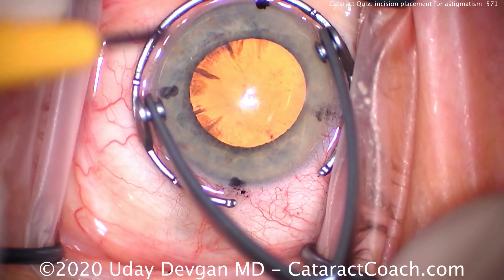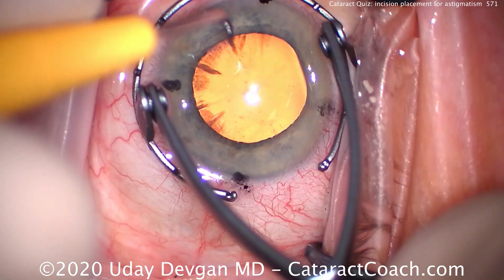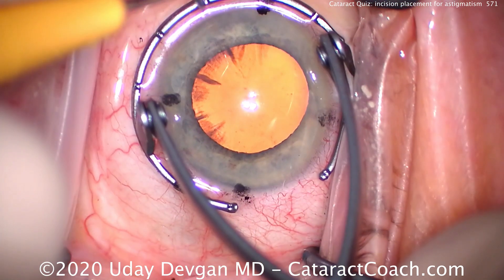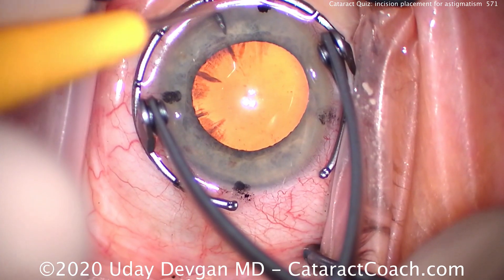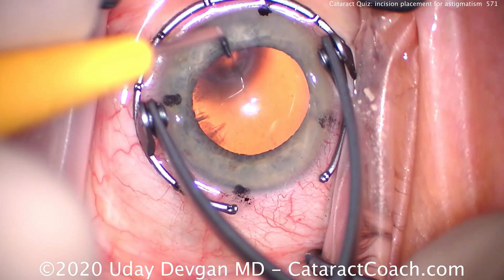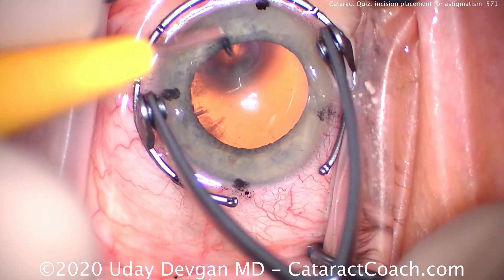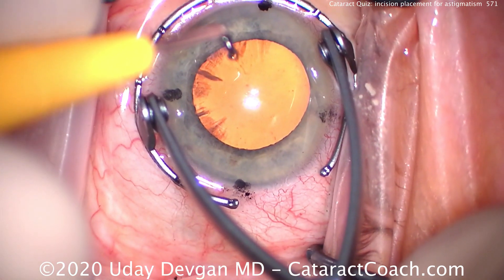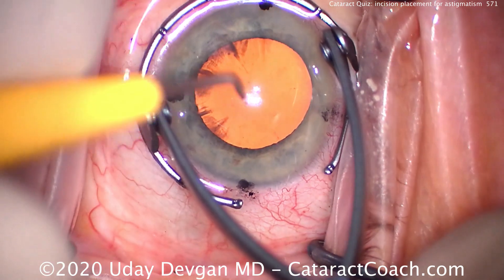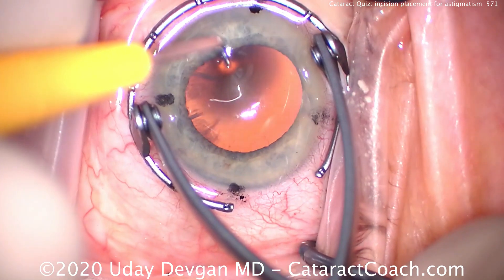is marked off in clock hours, so each of those is 30 degrees. Here's the opposite side, the 30 degree meridian as well, and we'll make those marks. Now we have a nice clear delineation of where our steep axis is — steep at 30 degrees.